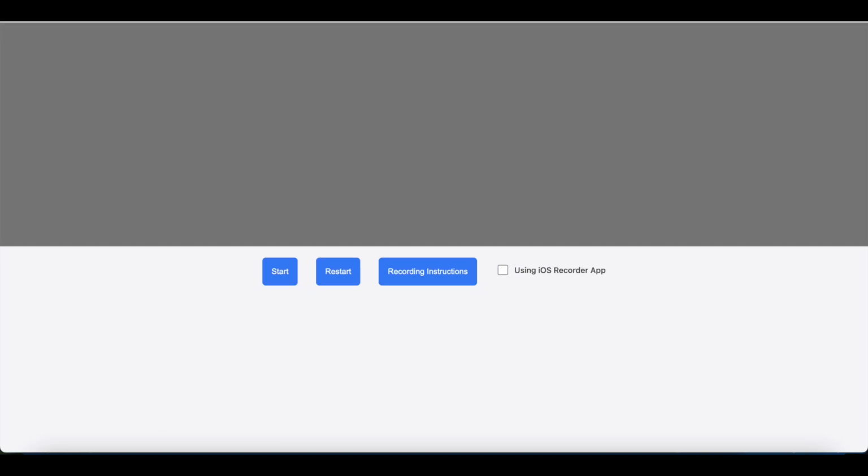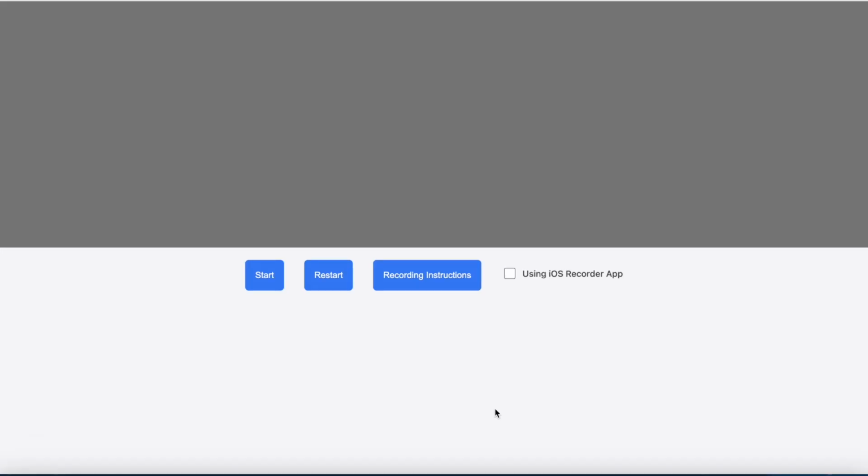So online can either just run the animations as is, allow the user to record their eye movement with the camera on their phone. They get the link, it tells exactly the settings that they need to use, just like in the EP Tests apps. And then it just runs the animation and the user is responsible for recording it themselves. So that's option number one.